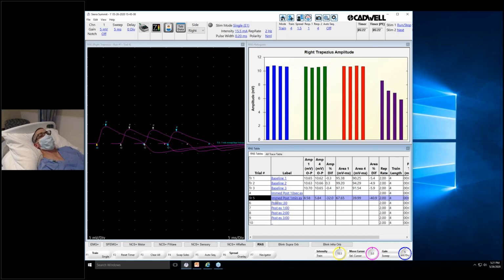So let's do the trap one more time. Okay. So what would you do if that happened? I'd actually turn down the intensity. So we were shocking at 7 instead of 15. Oh, you turned it down on purpose. Oh, okay. You were sneaky. So that went normally, how she was tricking. Right. Yeah. So we're back at the original stimulus amount.